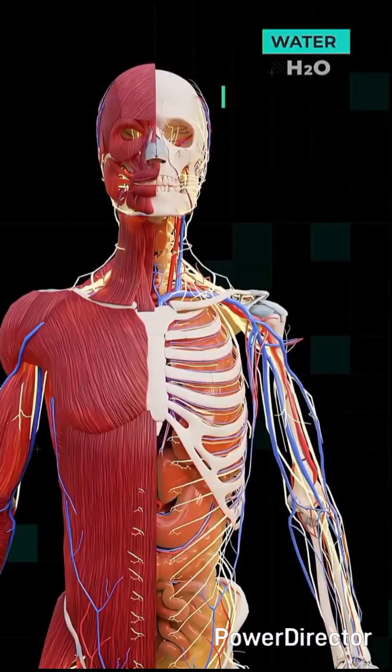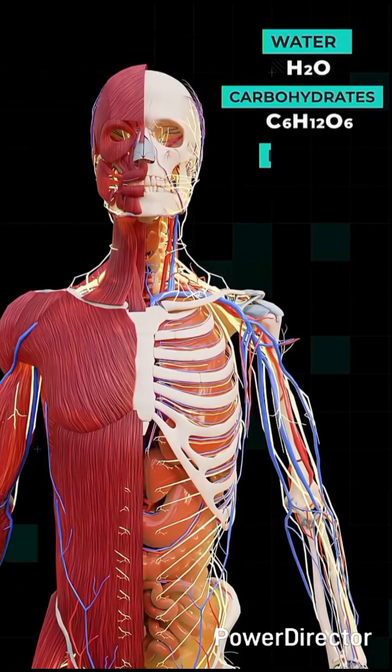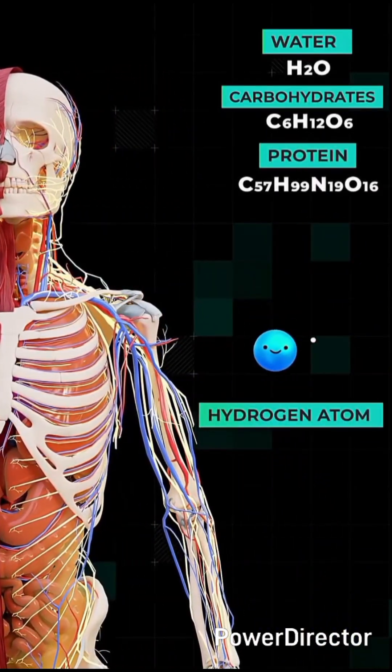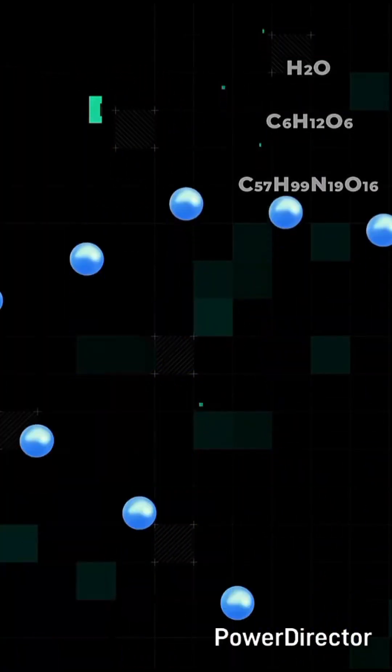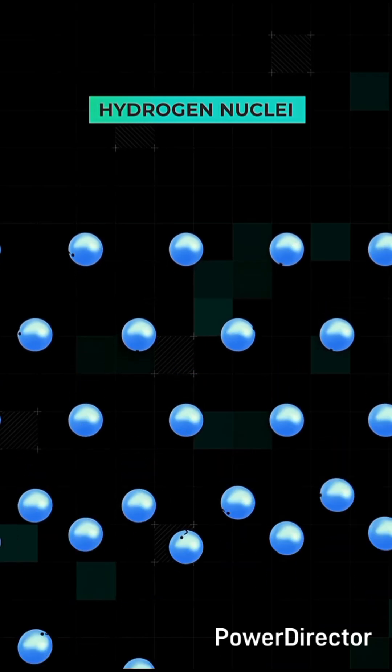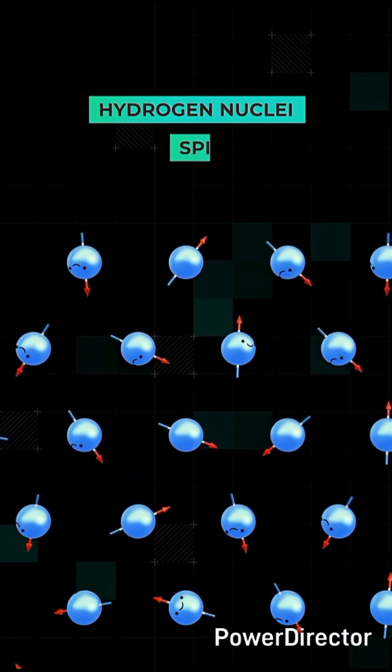Our body is mostly made of water, carbohydrates, and proteins, all of which are rich in hydrogen atoms. Each hydrogen nucleus behaves like a tiny spinning magnet, a property called spin.